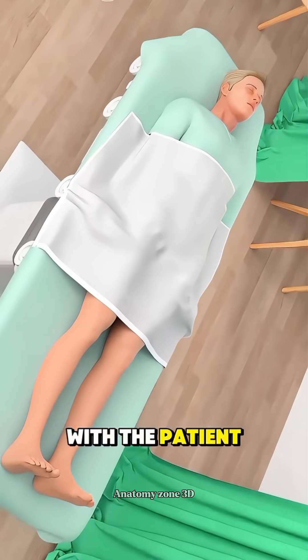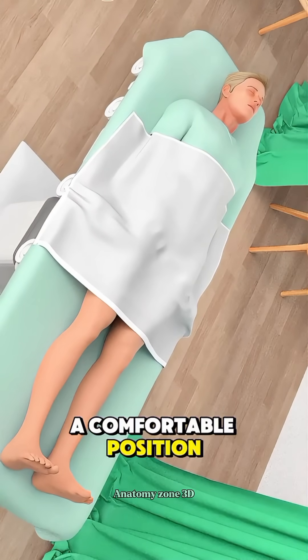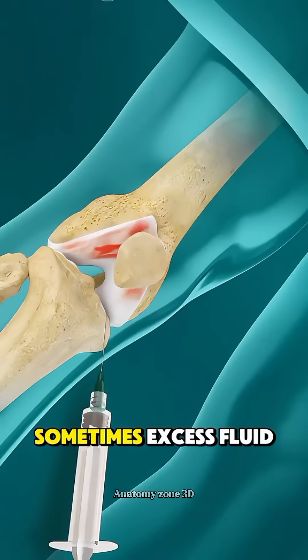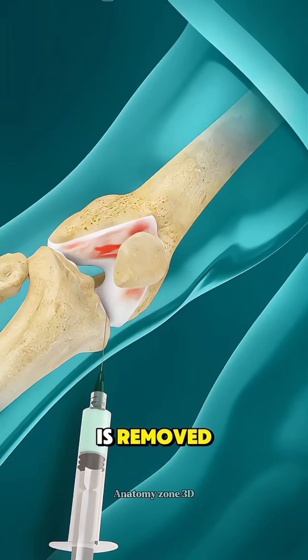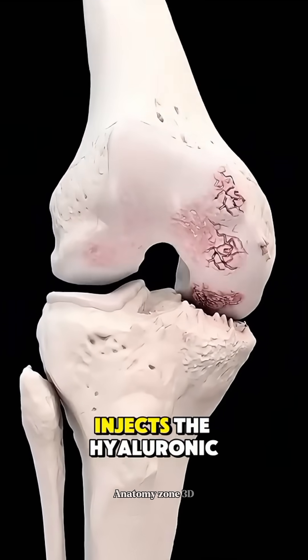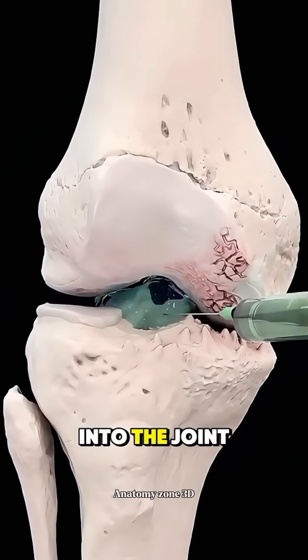The procedure starts with the patient sitting or lying in a comfortable position while the doctor cleans the skin over the joint. Sometimes, excess fluid in the knee is removed first using a needle. Then, using a fine needle, the doctor carefully injects the hyaluronic acid into the joint space.